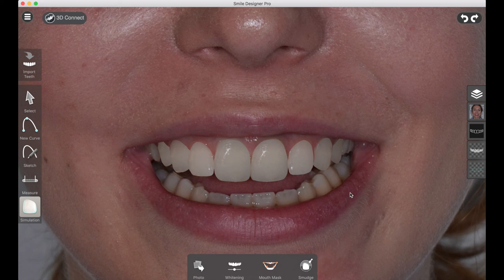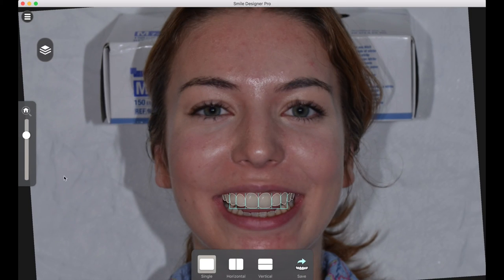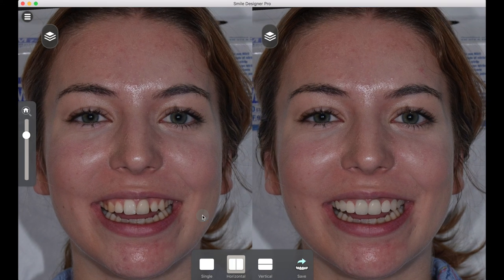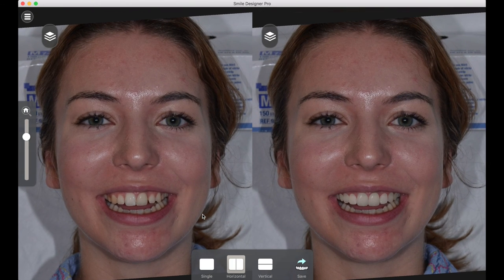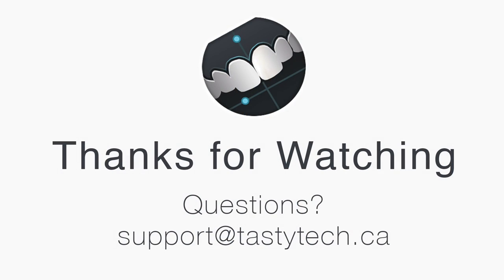The last thing to do is go to the export step and take a look at the before and after — and there's our final result. We can save this out and show it to the patient, and hopefully they will be excited by what they see. That's it for this tutorial. If you have any questions, feel free to leave them in the comments or email support at tastytech.ca and we'll be happy to help. Stay tuned for a lot more coming from us very soon.